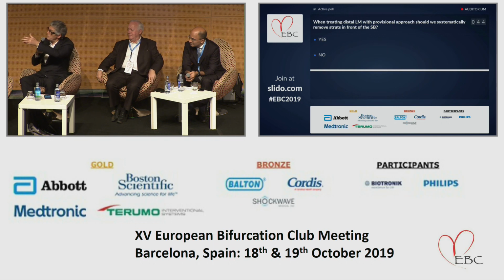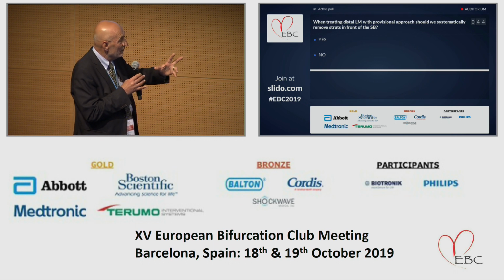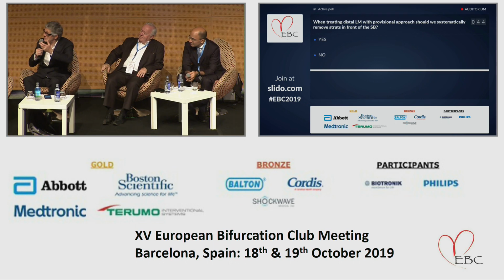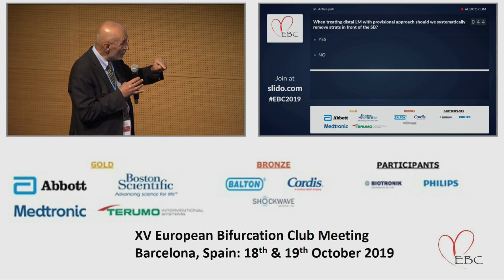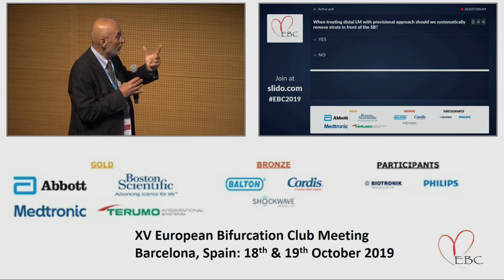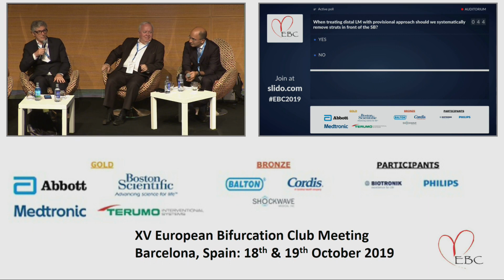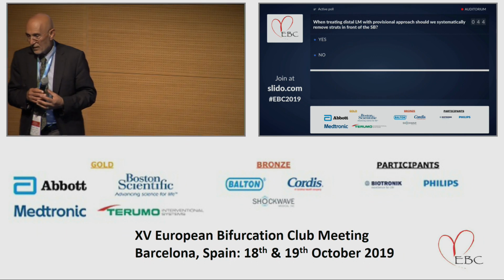So you are doing DK crush. We are all guided by bench testing. So if you are convinced, you should try to reproduce the same in the patient. In order to do like the bench, I should go with IVUS or OCT every time I'm doing it. That is the point. Second point, if I do not have any clinical benefit, why do it? I'm not doing that for me. I'm doing it for the patient.